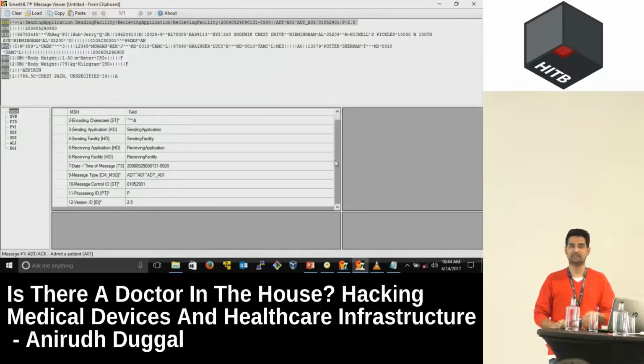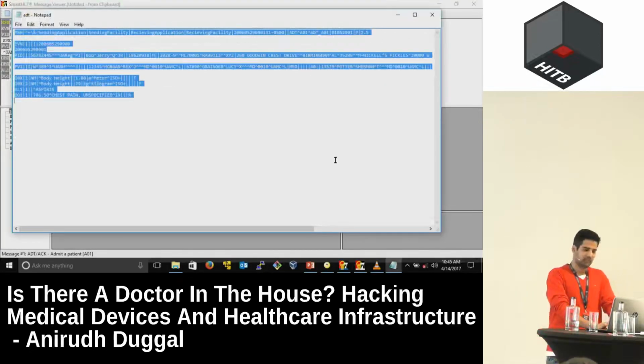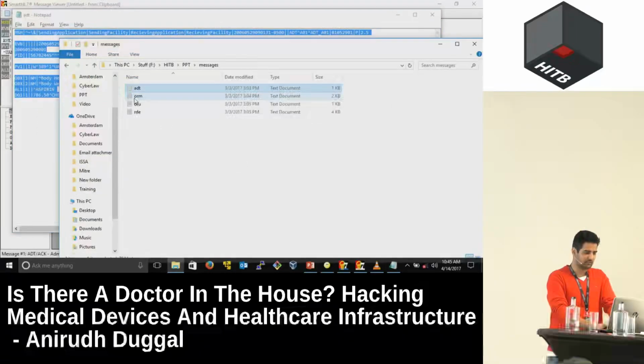Right? This was a big challenge in the US. About 2 years ago, they released a report where they said that 100,000 patient monitors were deemed unusable, and no one knows why, because they could not investigate the root cause of it. There were no logs. Again, let's look at some of the other messages that these guys have.